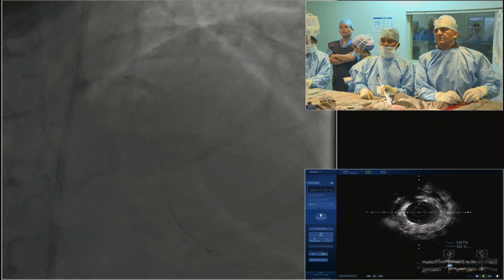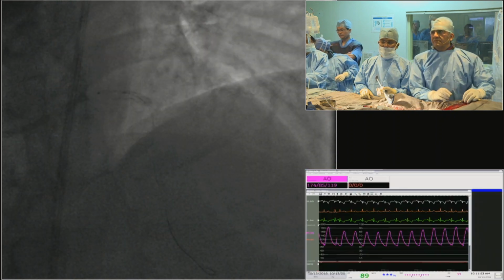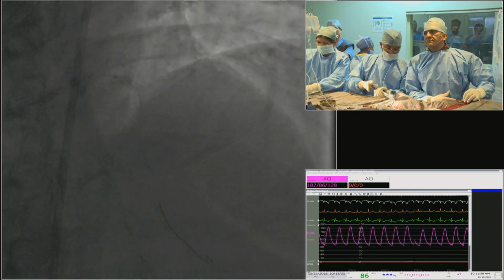There was no point doing an IVUS. He was trying to bookmark and define the distal unopposed stent. But you have to do that even after optimization. We probably must do that again.